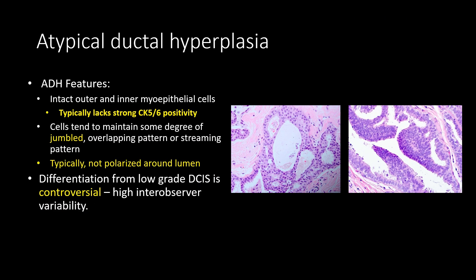Compare this to atypical ductal hyperplasia. Again, we'll see an intact layer of myoepithelial cells, but we're going to see jumbled glandular cells that are not polarizing clearly around a lumen, and a slightly weaker CK5/6 positivity. An important point about ADH is that it can be difficult to differentiate from low-grade DCIS, with a lot of inter-observer variability, making the diagnosis somewhat controversial.